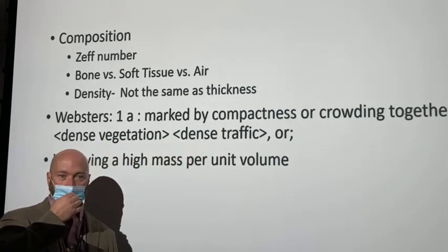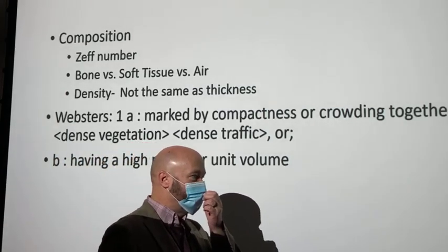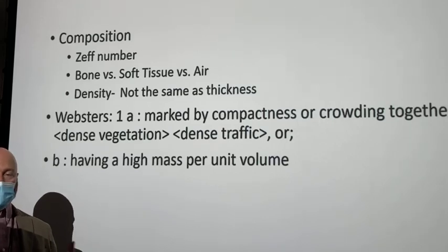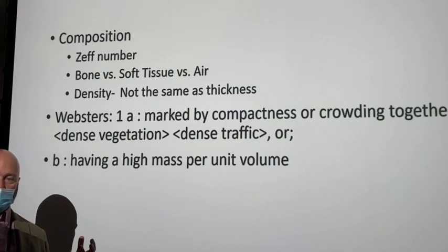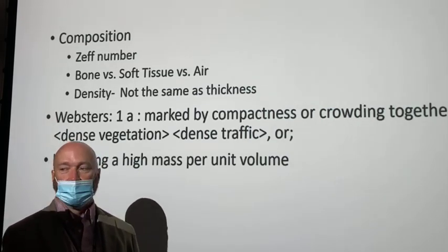And if you look up the two on the periodic table, the difference between the two is not all that great, right? Atomically, they're not that far apart on the periodic table, which means that their actual atomic number and their absorption characteristics are almost identical, okay? So the difference really becomes the amount of that atom in suspension inside the stuff that holds it.